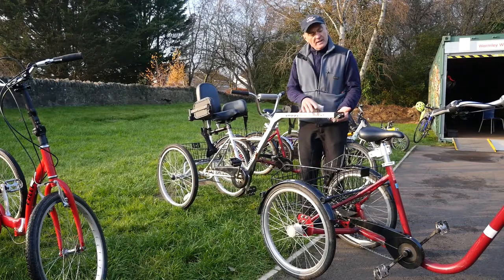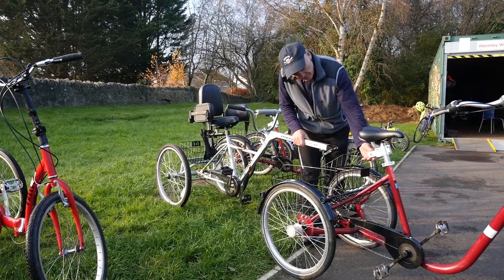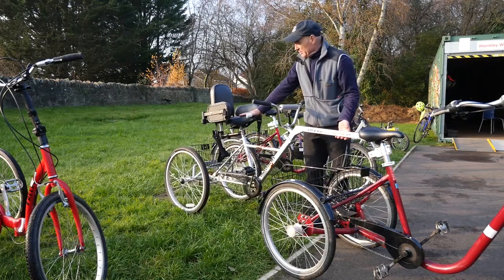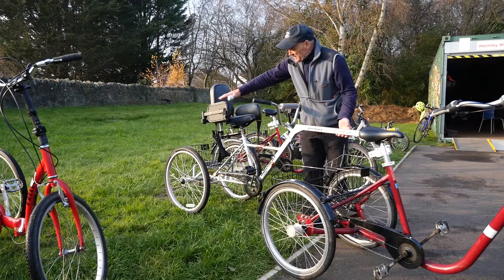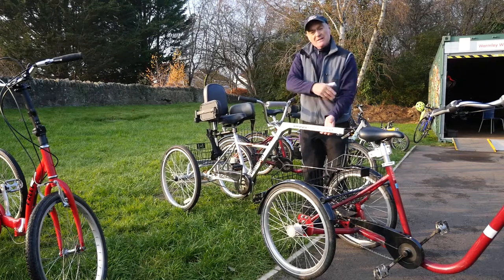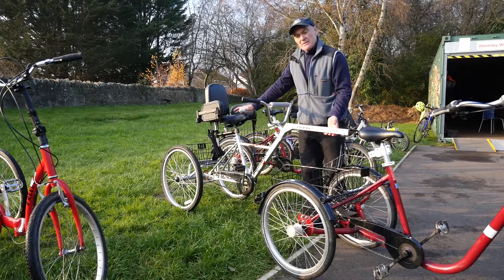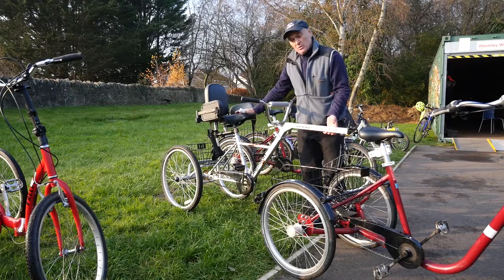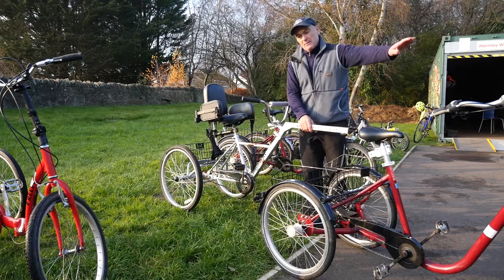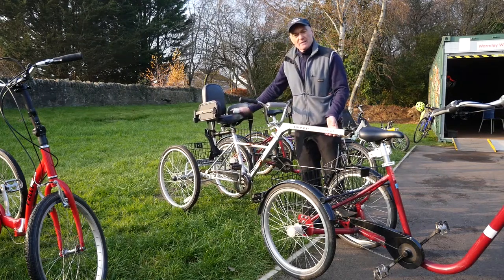This is called a tag-along and it attaches to these maroon Quest Endurance trikes. There's a moving bracket at the back that fits here, and the service user sits in this saddle. One thing to be aware of is that the service user is behind the carer, so verbal instructions are very difficult. They need to be essentially quite calm and passive, because anything they do that could cause an imbalance can't be seen. We do have wing mirrors on the front to give some visual inspection.